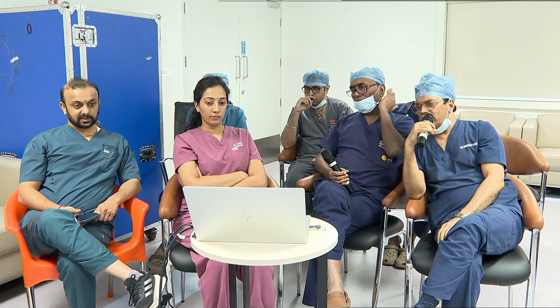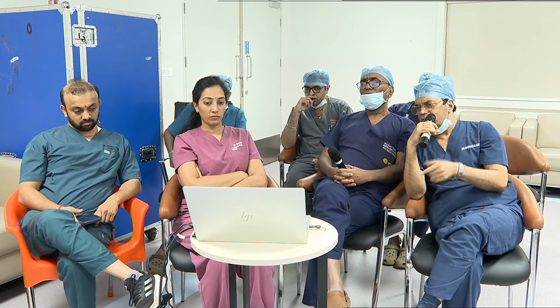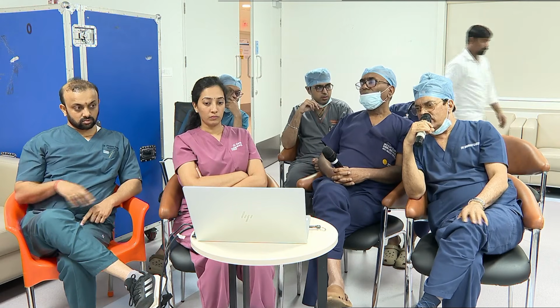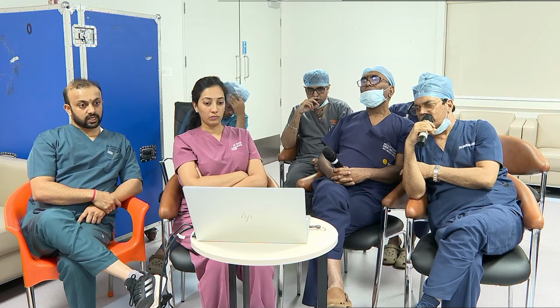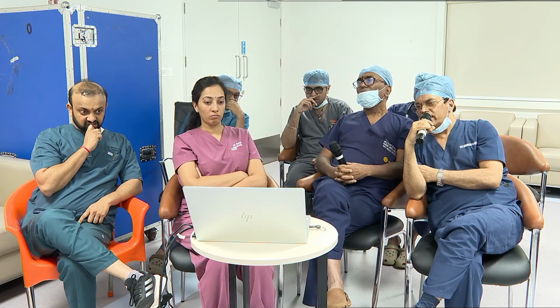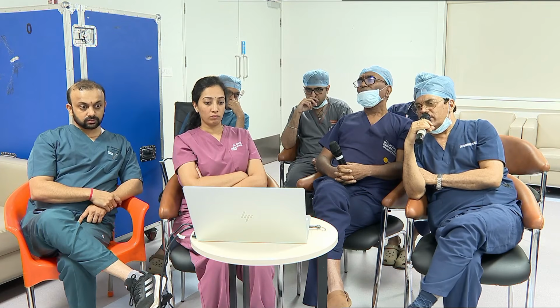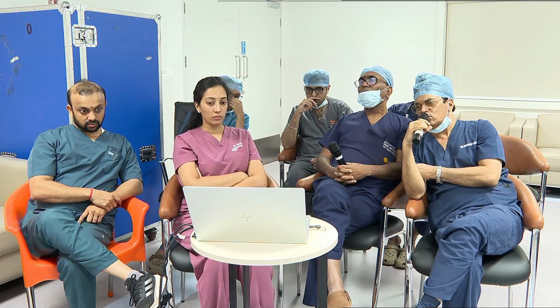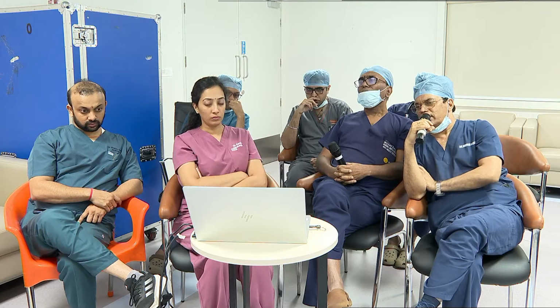So the basic advantage of this, one is device delivery, another one is coronary access is very good because the cell size is much bigger. So that's the reason you can access the coronary arteries very freely. Moreover, it's self-expanding, so annular rupture is very less likely. But the only thing is, once you implant it, if there is a paravalvular leak, take an upsized balloon and you can increase the size so that the paravalvular leak can come down. These are the important issues in implanting this valve.